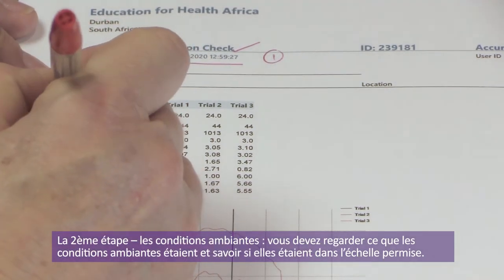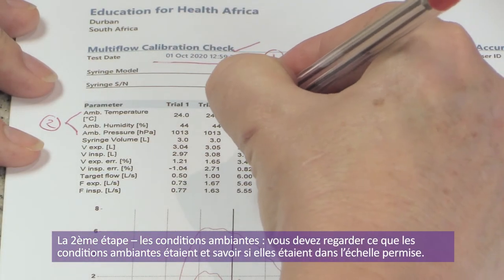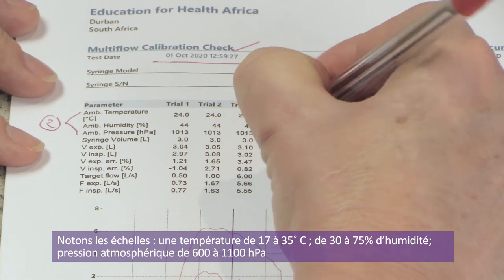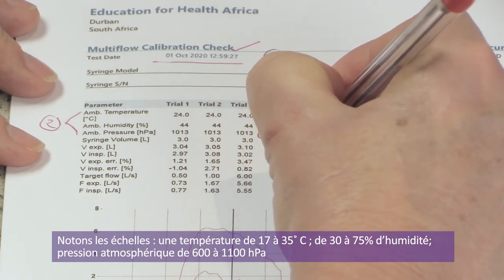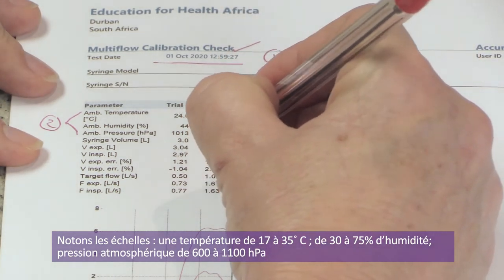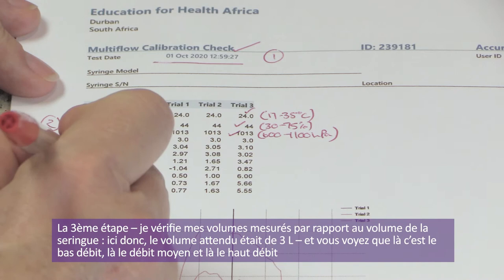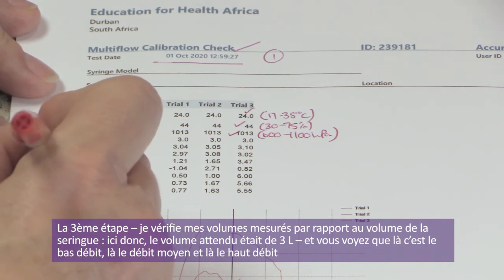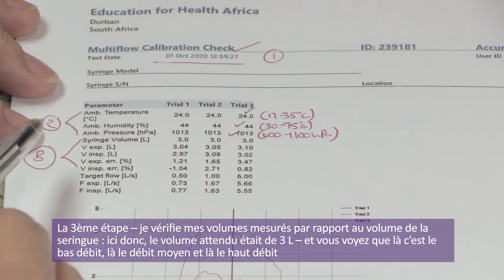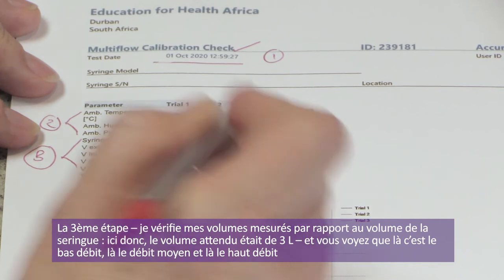Step two is ambient conditions. The allowed ranges are 17 to 35 degrees Celsius, 30 to 75% humidity, and 600 to 1100 hectopascals barometric pressure. All these values are within the allowed ranges, so my ambient conditions are good. Step three: I'm looking at my measured volumes versus my syringe volumes. My expected volume is three liters. My volume expired on low flow is 3.04 — within range.